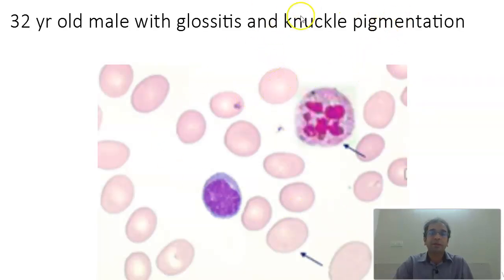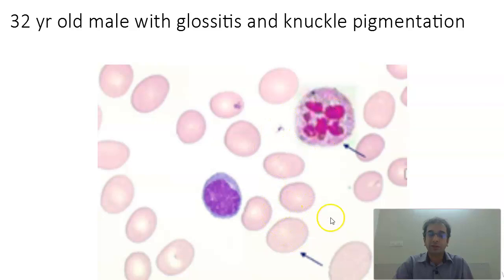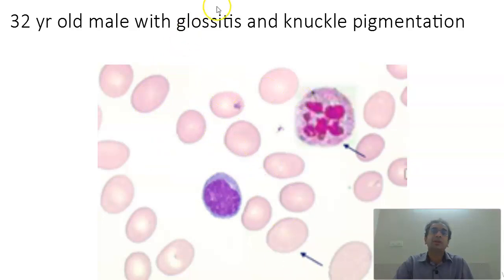Coming to the next slide: a 32-year-old with glossitis and knuckle pigmentation. What you find is a hypersegmented neutrophil with more than 5 lobes — 6 lobes here. Macrocytes are present; the cells are round and oval macrocytes. Comparing with the lymphocyte as reference, this cell is definitely a little larger and oval in shape. The history is also clear — glossitis goes for vitamin B12 deficiency and knuckle pigmentation again goes for vitamin B12 deficiency. So this is a case of macrocytic anemia.